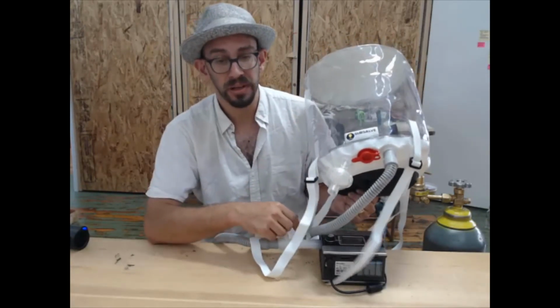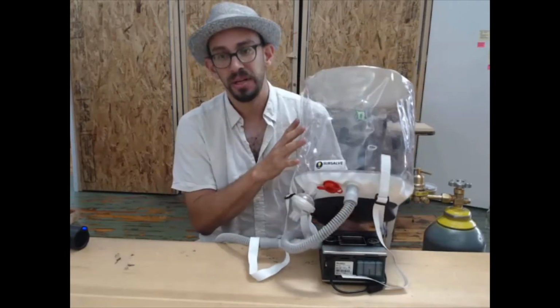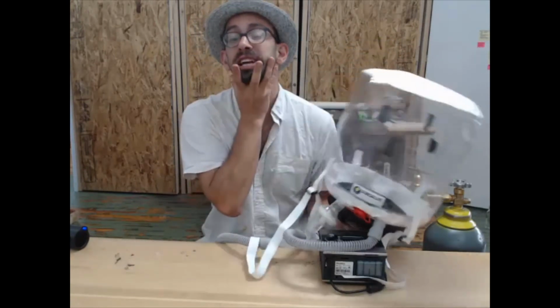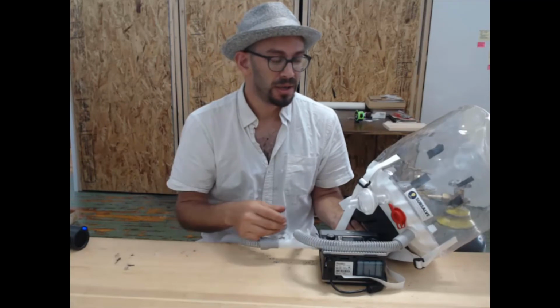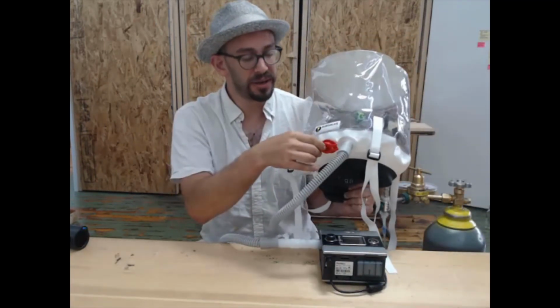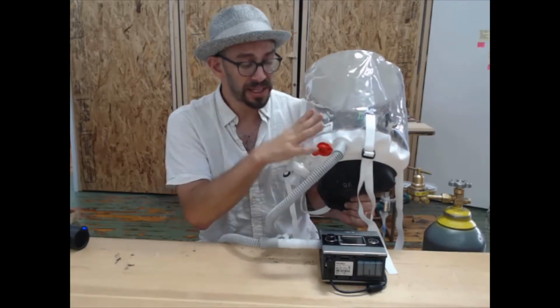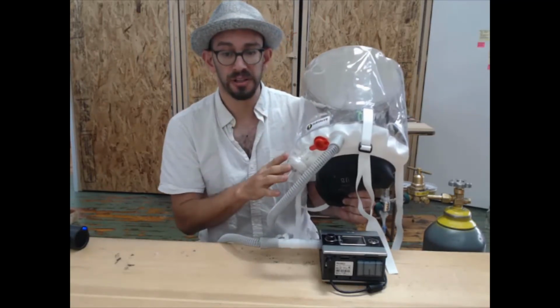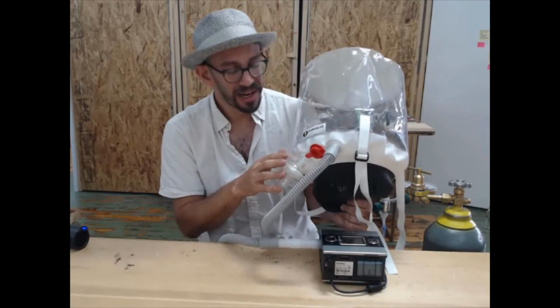These armpit straps are important because they hold the hood down on the patient. Without them, the hood will inflate and push against the patient's chin and throat, and the straps pull it down and make it comfortable for the patient. Once you have the straps secured, then you can close this access port, and now the patient is sealed off. Healthcare workers are prevented from being exposed to that patient's expired air, and the patient is comfortable.